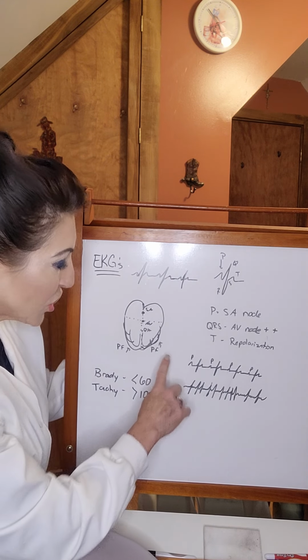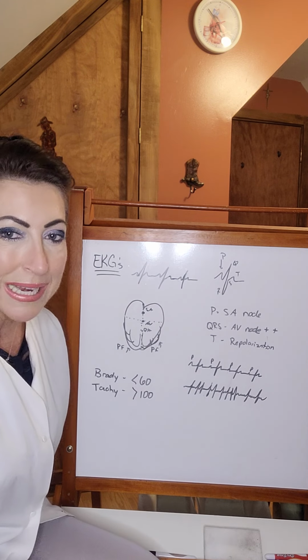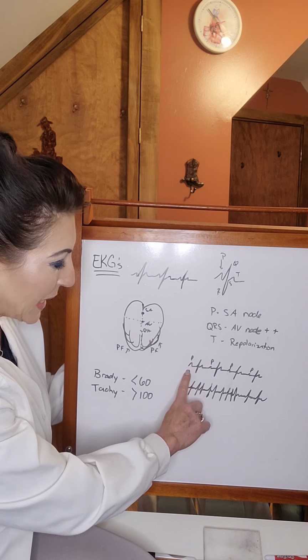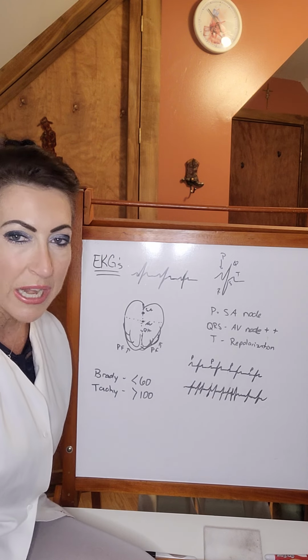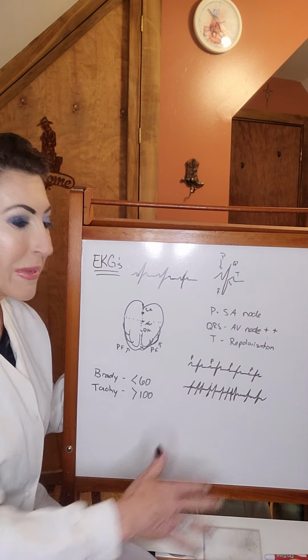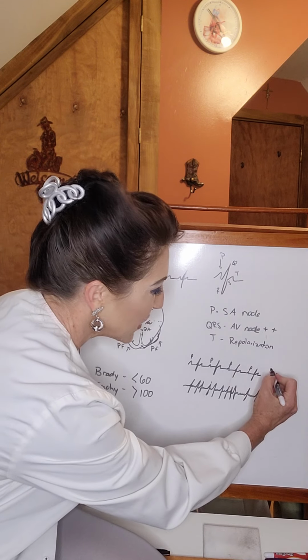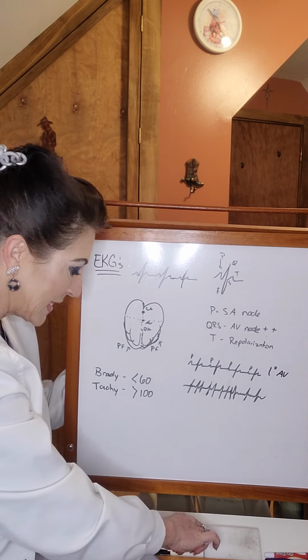So in aspect, what I mean by things could go south or things can be just fine is that when you have a P wave and that distance between your P and your QRS is altered in any way, too short or way too long, or systematically damaged, then you're going to see a change. Like for this instance, and I should have labeled it, this is first degree AV block, which is very common. We see it a lot.